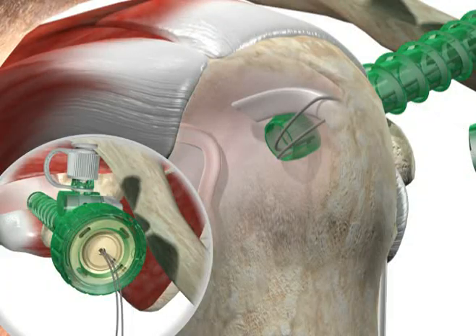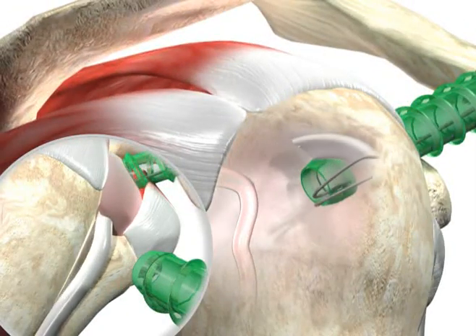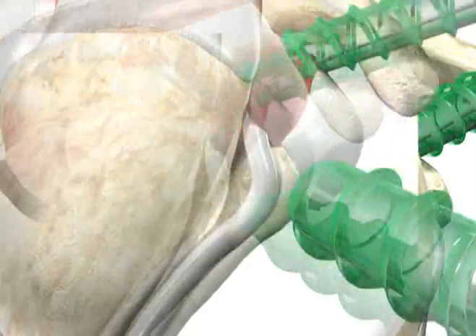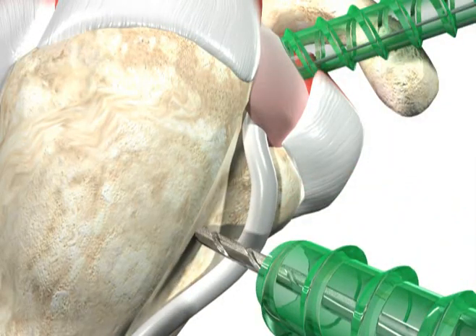Retrieve the remaining arm of suture so that both arms exit the interval portal. Perform a bursectomy down the face of the humerus anteriorly and mobilize the biceps tendon out the bicipital groove. Move the tendon to the side. The tendon fork can be used to assist with this.